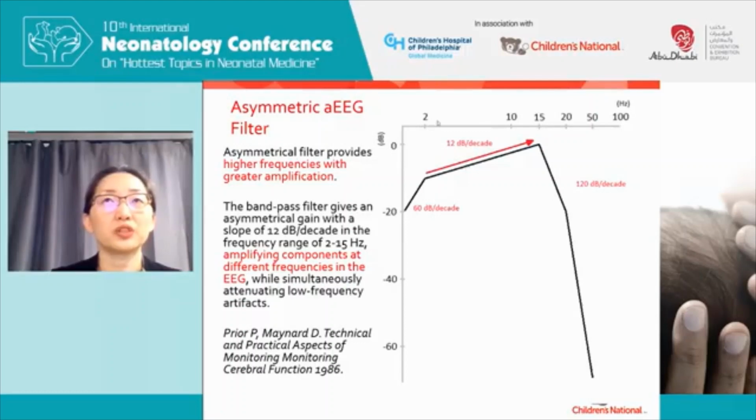Why 2 and 15 hertz? Because in an adult patient getting their post-op heart procedure, the majority of the waveform should be in the theta and alpha range. And therefore, they wanted to accentuate that by weighting it in a linear fashion.